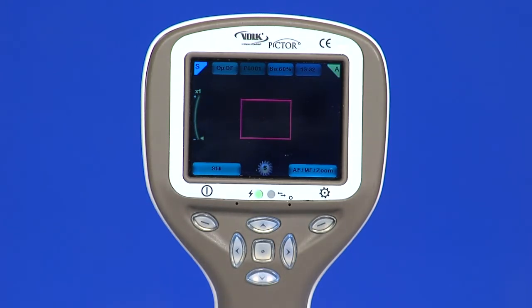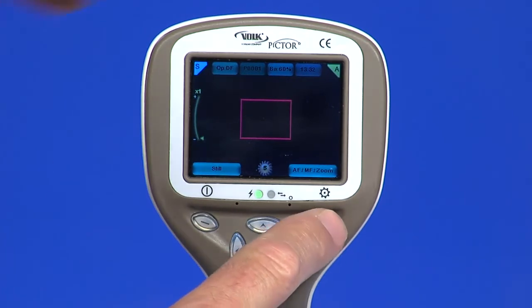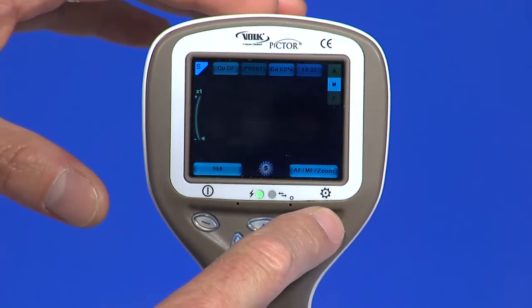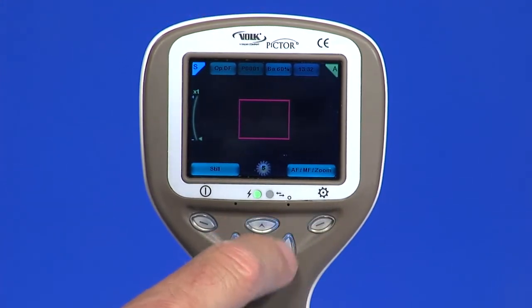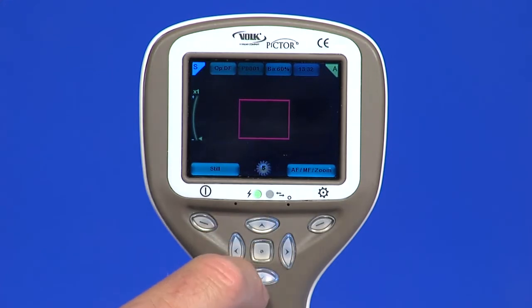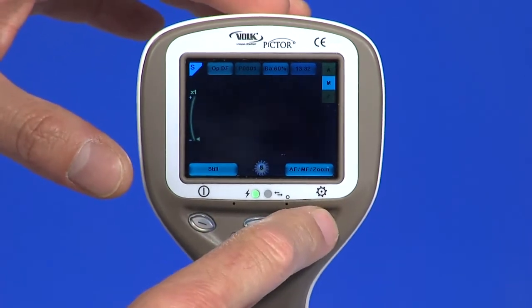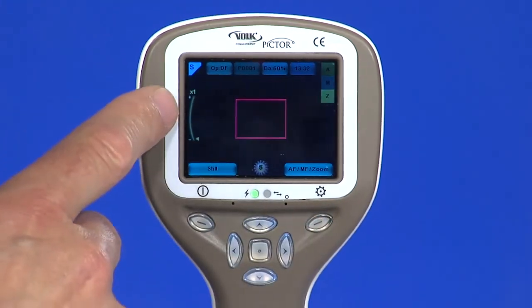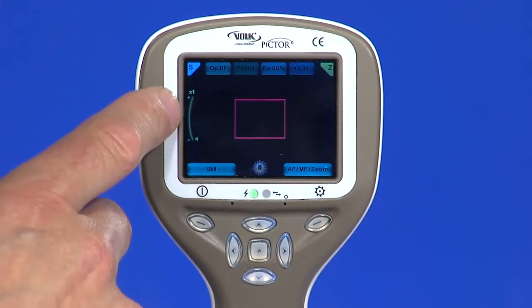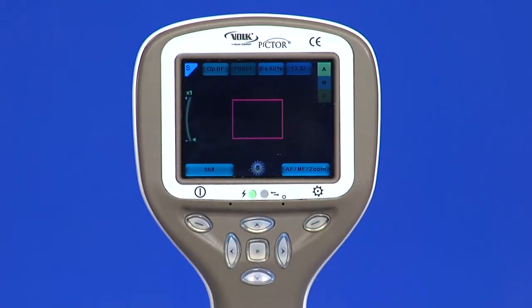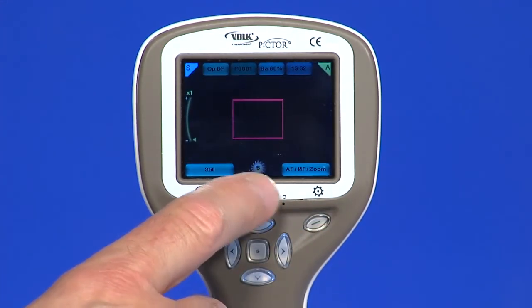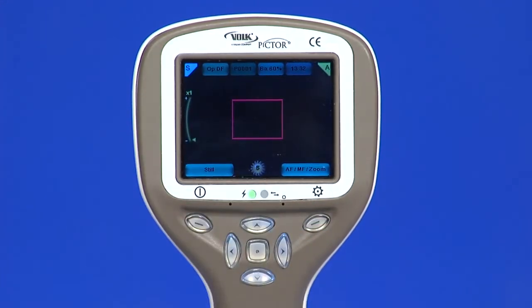These can be changed by pressing the right soft key. Focusing can be adjusted using the up and down arrows. When zoom is selected, the scale on the left of the screen displays the level of optic zoom selected. In the middle of the bottom screen is the illumination level of the white light, which can be set between 1 and 10.